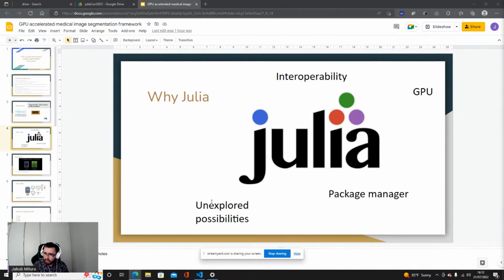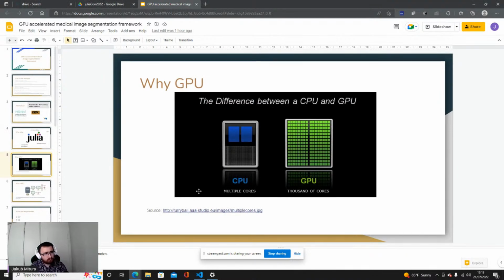However, in the case of Julia, if you want to do something new, if you think about some new algorithm, it's, at least in my opinion, far easier to achieve because it's easier to cooperate, to get some new idea from idea to execution and to use the huge amount of tools that are already implemented. So this is the basic idea: why Julia, and why I did it.